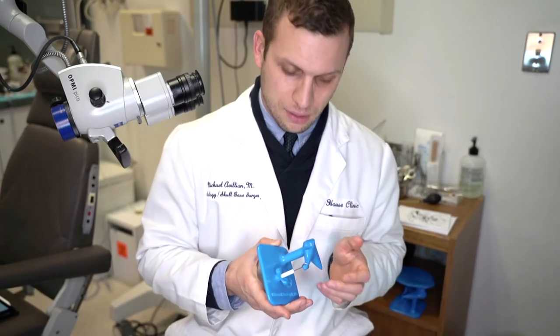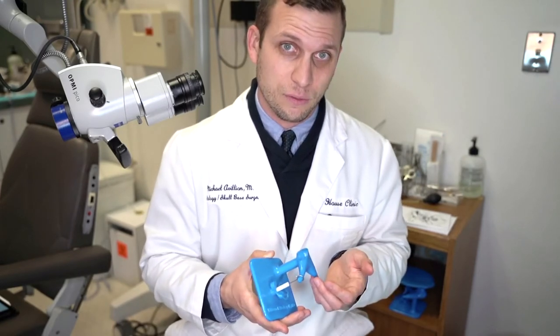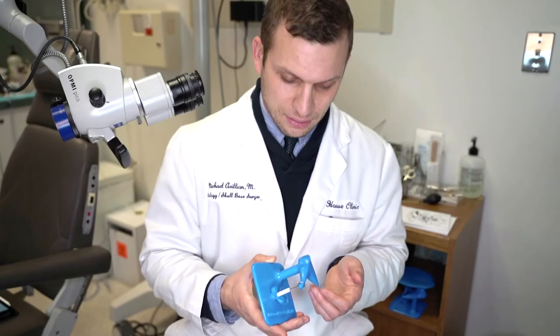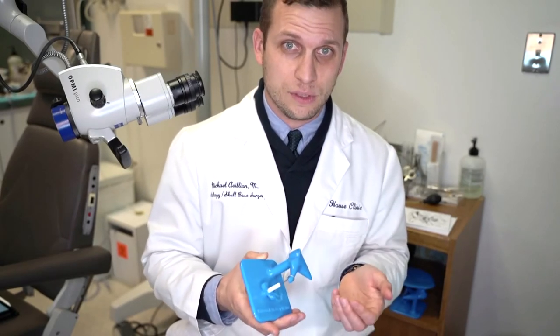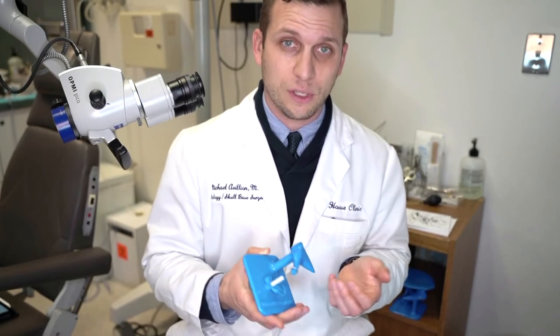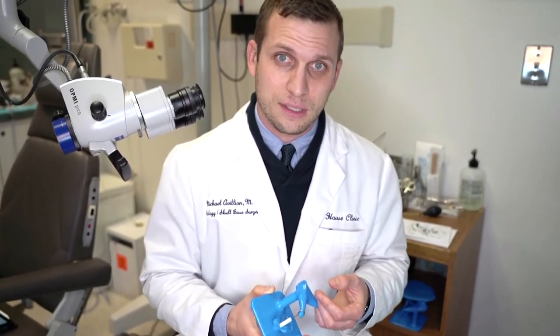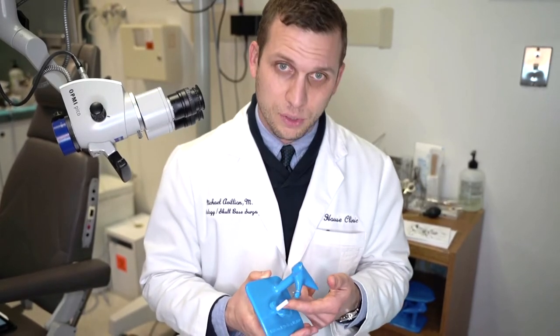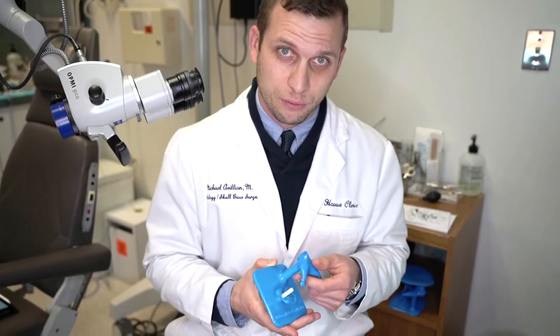Both of these use a prosthesis as a replacement for the stapes function. In experienced hands, there is no difference between the two surgeries as far as outcomes go. However, here at the House Clinic, the procedure known as the stapedotomy is what is most commonly performed.